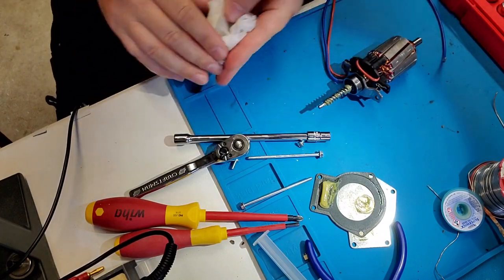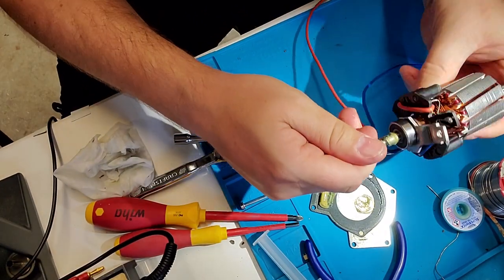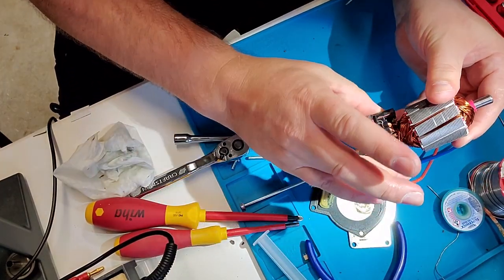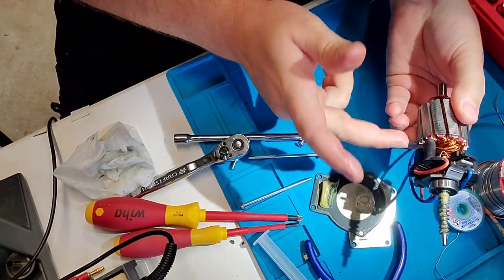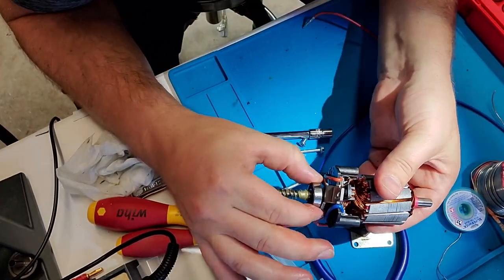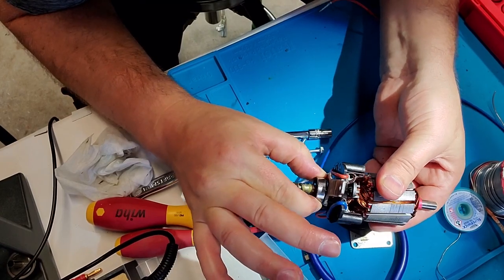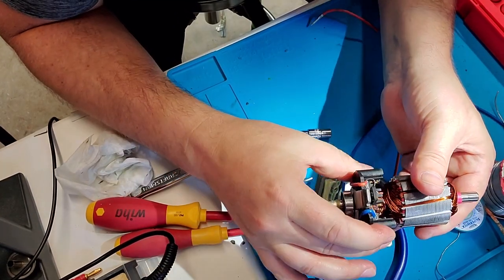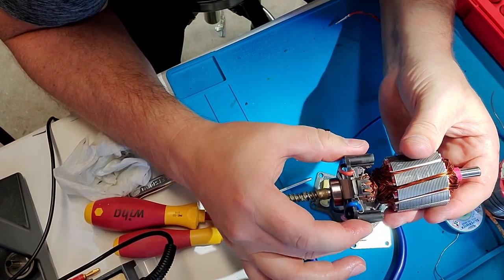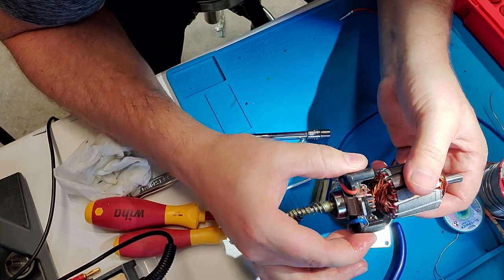Got grease on everything. See, that's normally why I wear gloves. So you've got two brushes right here and right here. The brushes look excellent. The commutator bar looks excellent. This bearing is pressed on, and I can't move it. Everything looks like it's in excellent condition, almost brand new.